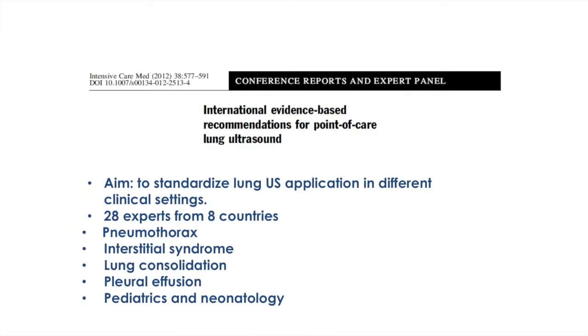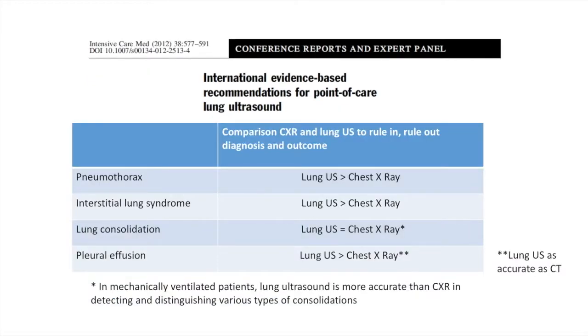In view of the large numbers of publications and the need for standardization, international evidence-based recommendations for point-of-care lung ultrasound were published in 2012. Aim was to standardize lung ultrasound application in different clinical settings. It involved 28 experts from 8 countries who met 3 times over 1 year and published 73 recommendations, out of which 65 were in strong agreements. This involved pediatrics and neonatology as well.